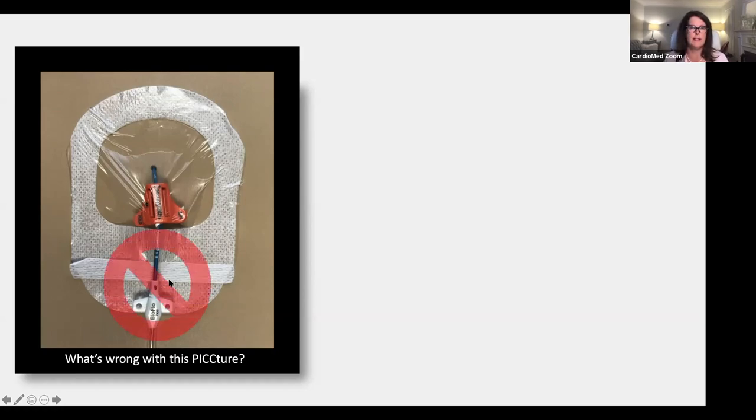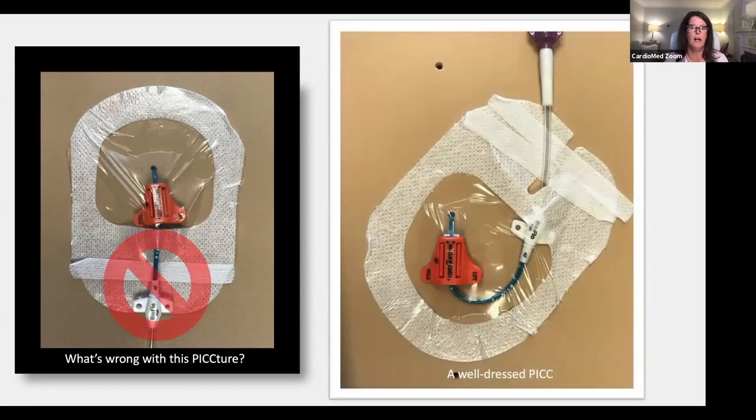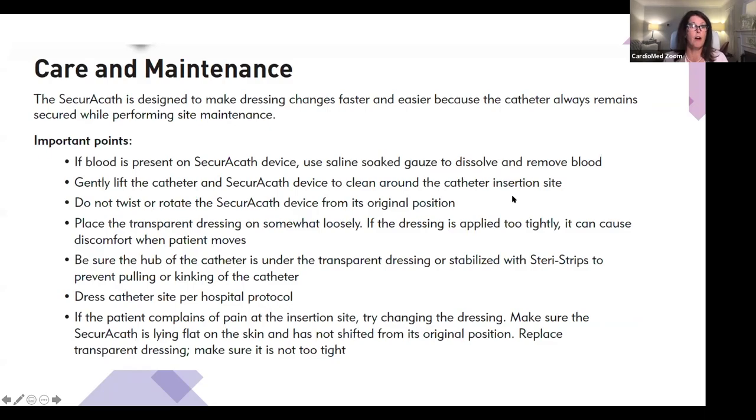So when you're dressing the catheter, make sure that you have the entire portion of the catheter under the dressing. If you do happen to have a longer segment of the catheter that is exposed, you can curve it, making sure it's not twisted though, so that it is all underneath the dressing. There are a few tips here on care and maintenance. I'm not gonna speak to them, as Michelle's really gonna delve into some of the tips and tricks, the clinical pearls in caring for these devices.